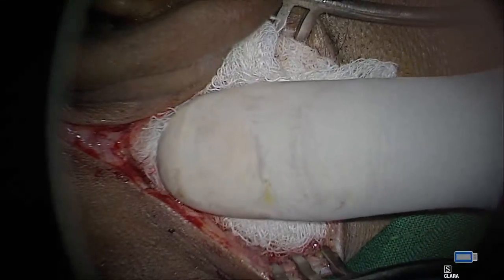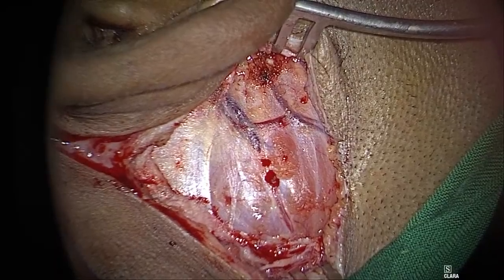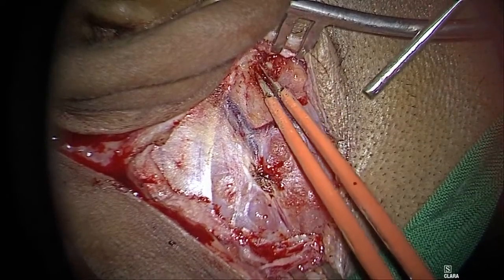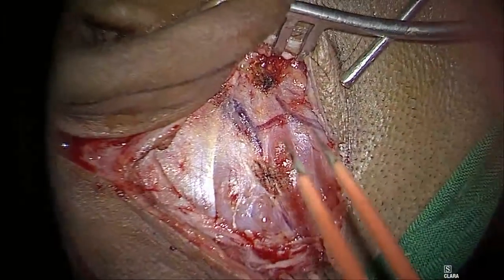So it's a fairly big fascia which I've taken. Always take a big fascia. This is something bipolar. You have to irrigate when I do bipolar. Okay, I see that's absolutely bloodless. There's no problem here.